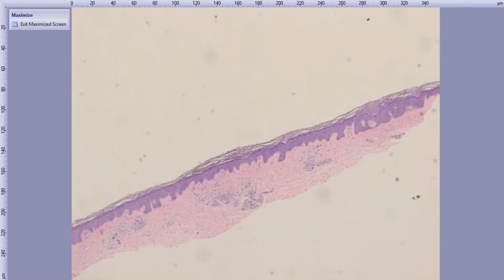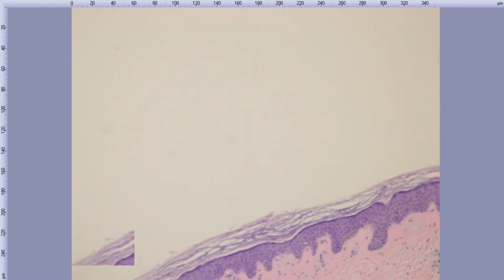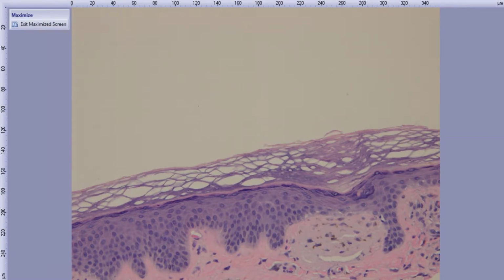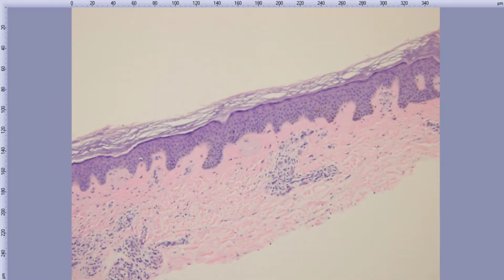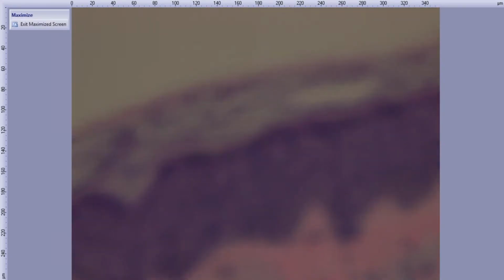And then this one here, I think I kind of honed you guys into a couple of areas. I don't know if that helped or not, but let's see. This is one of the areas I took you into. You guys have any ideas for that? Macular amyloid? Macular, is that what you said, macular amyloidosis? Yeah, that's what that is. So these pale mini nodules of amyloid material. Let me see if I find another one here. Yeah, here's actually a little aggregate of it right here. That little collection of material is amyloid.